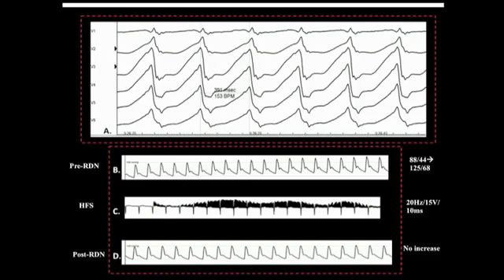In this case, with the combination of epicardial and endocardial mapping as well as renal denervation, we're now about 8 months out. We do not have a loop recorder in place, so obviously all monitoring with AFib is limited, but we do 3, 6, 9 and 12-month 2-week monitors for all of our AFib patients, and to date this patient has been AFib free.